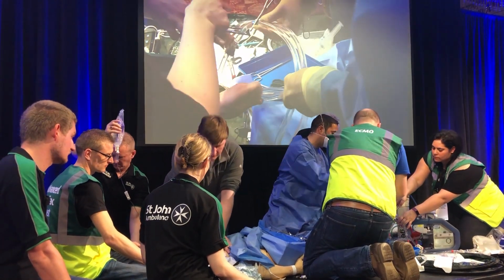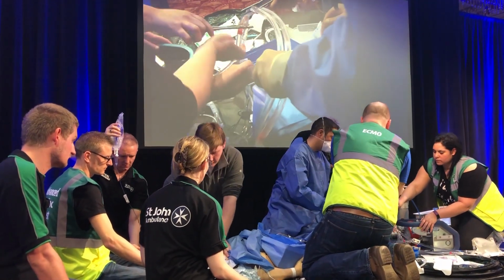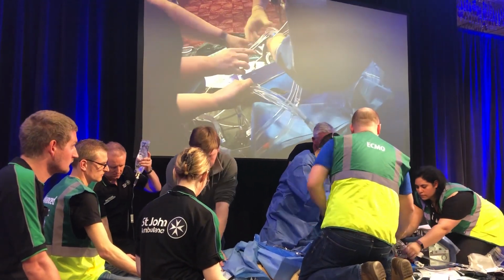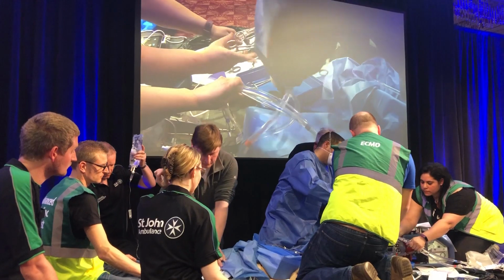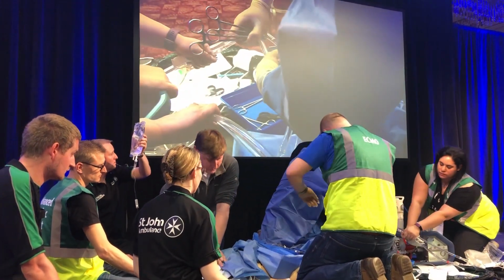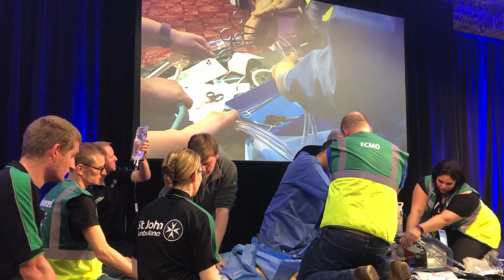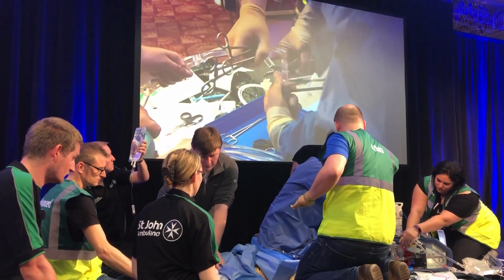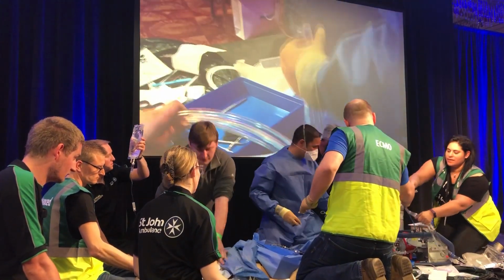In terms of compressions, some people advocate continuing compressions even on ECMO for a bit, just to prevent any clot forming around the aorta and the aortic arch. I think we judge it per case, as to how long the CPR has gone on and how worried we are about the clot. We probably use echo to have a look and see whether the aortic valve opens.